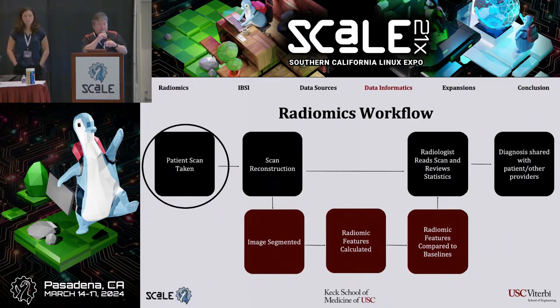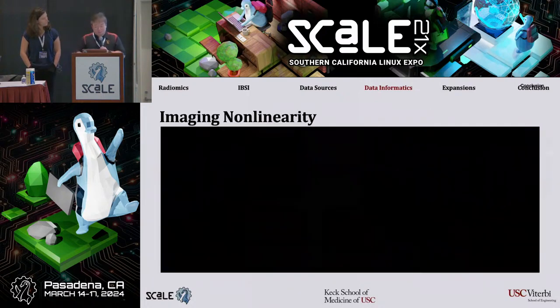So I hope you're getting a taste of the complexity behind this and what we're trying to actually get out of this quantification. It's not a simple one layer. You process these images and then you can just compare them straight off. There's a lot of underlying differences in the acquisition and the construction of these images before we even get a chance to start looking at them.